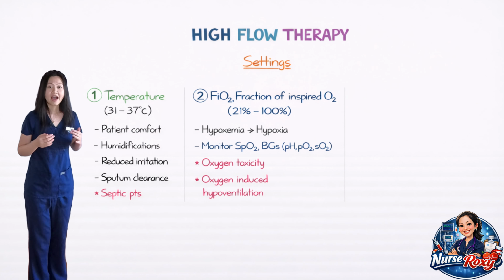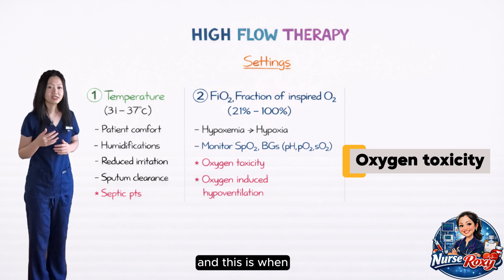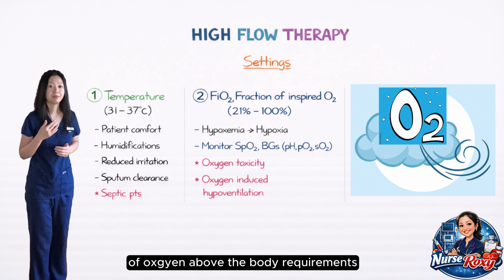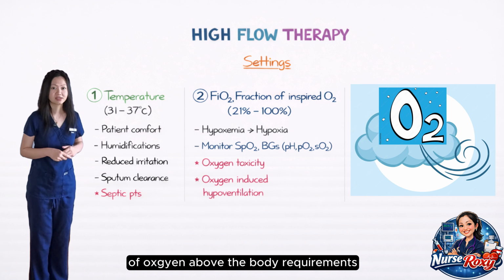complications. One of the most common complications is oxygen toxicity. This is when you administer a high concentration of oxygen above the body requirements, and this in turn can cause damage to cells and tissues.